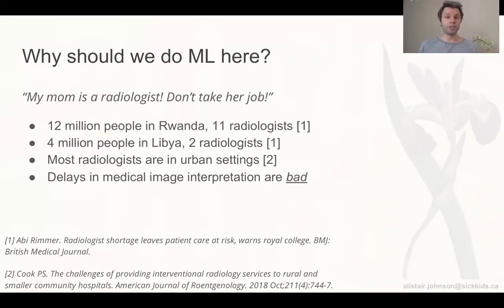You want to understand what's going on with the patient as early as possible to help them as early as possible. And it's not just limited to resource constrained areas. Even in very resource rich areas like the United States, rural areas tend to not have that many radiologists, and it's an important consideration for those areas as well.